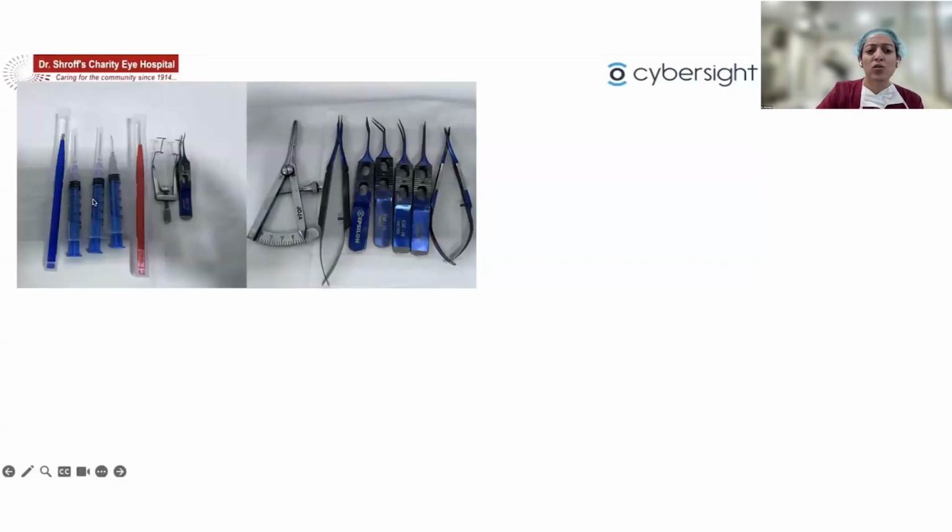So we have the regular intraocular instruments that we will use for any cataract surgery also. In addition, we'd use some extra instruments. So, routine side port blade, and we'll use a keratome blade, which is a 2.8 millimeter entry. We have two important 2cc syringes. We usually prefer the BD syringes because they have a very smooth passage. It's always preferable to have separate cannulas for hydro and for air. We prefer to use a screw speculum instead of a wire speculum. A caliper needs to be there on the trolley to measure.